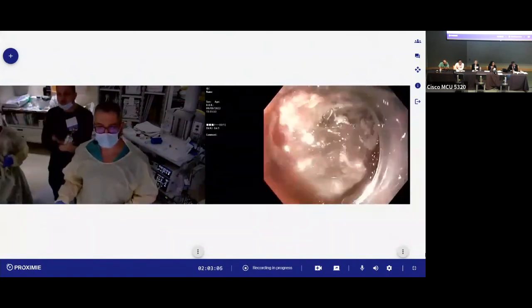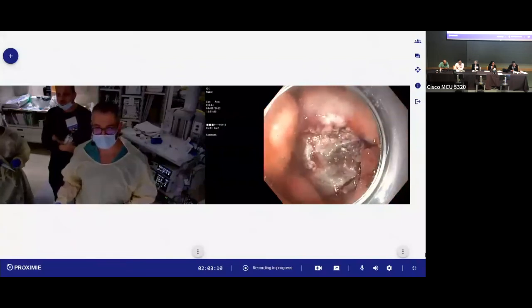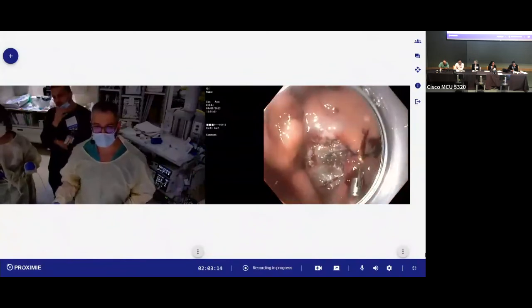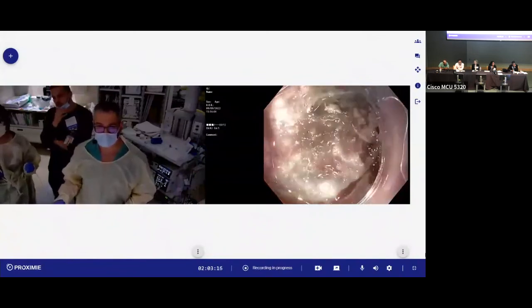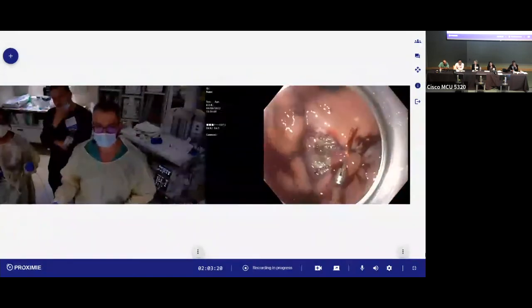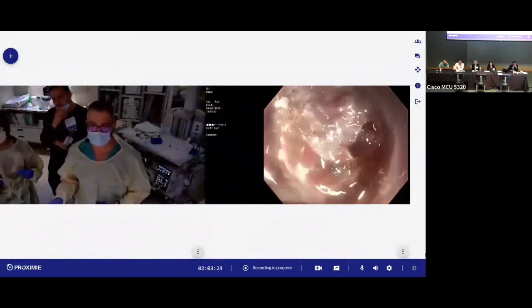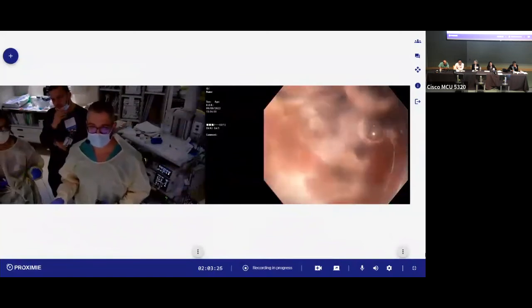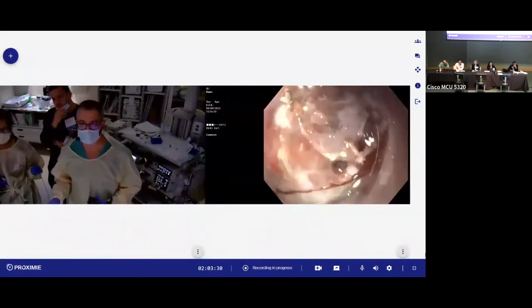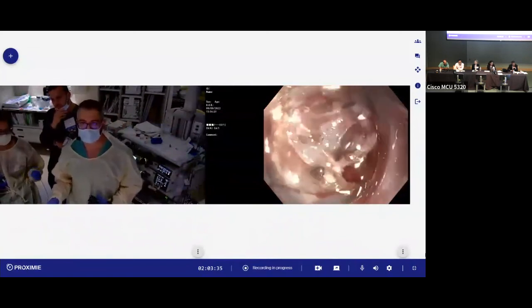Right, Mohammed, I was about to say that this all looks like just scarred submucosal tissue, and probably the area that you've covered might have had that small area, but we are not able to appreciate it in what we see right now. Right there at 3 o'clock, I think we're seeing a little bit of the splayed circular muscle. I don't see it through and through per se, but yes, that's the one. That's the muscle injury exactly. But it's not that big.